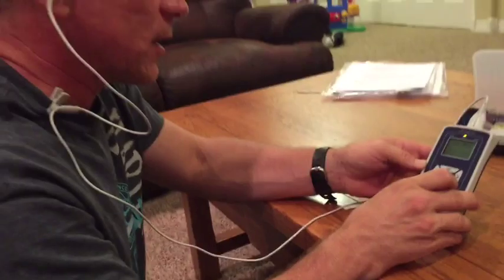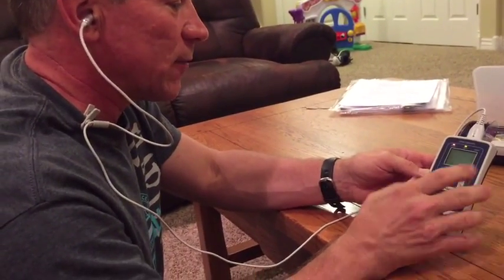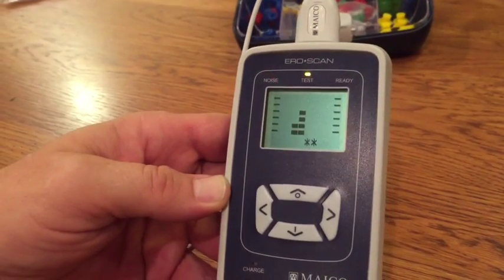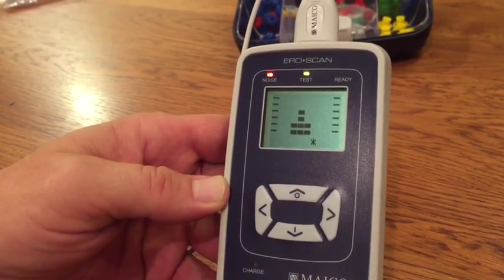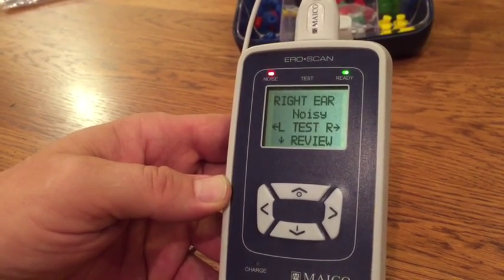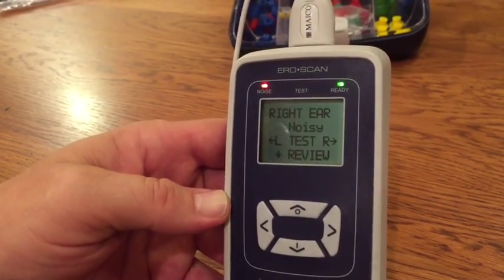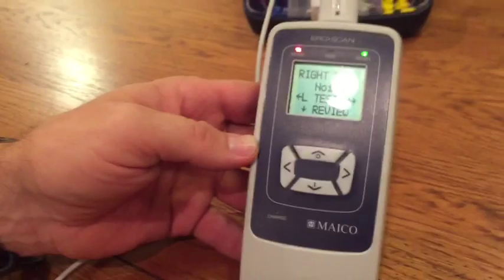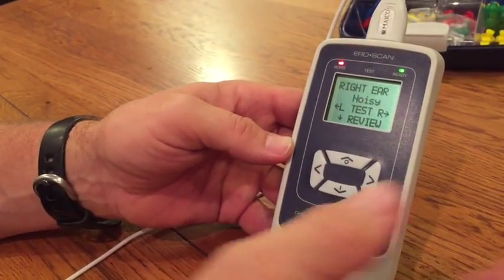Counting aloud generates internal noise during the test. The test result shows that it is noisy — because too much noise was generated for the test to continue. This demonstrates how internal noise from the person being screened can interfere with and disrupt the OAE screening result.